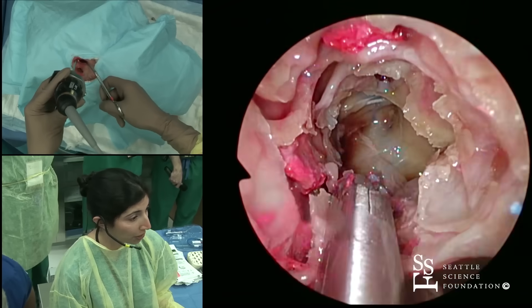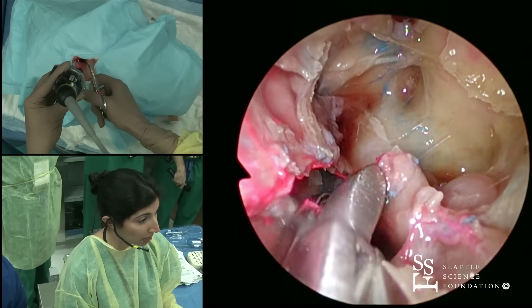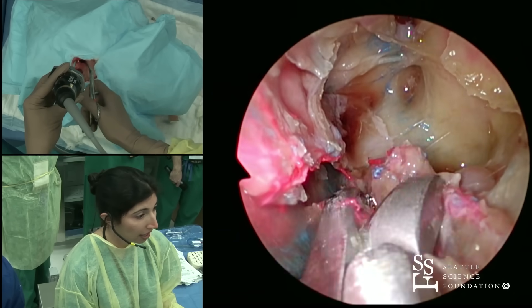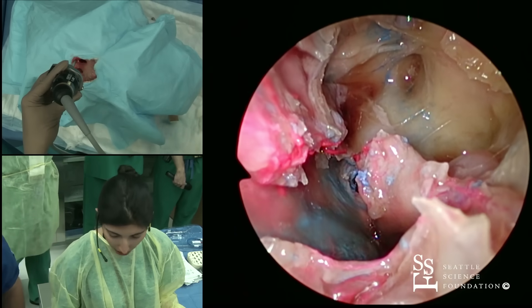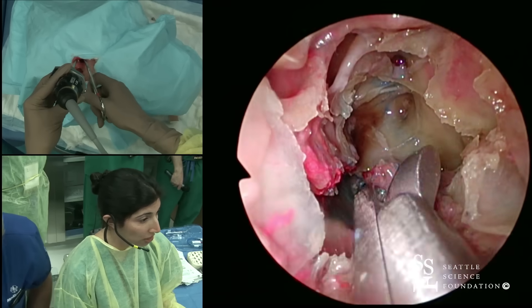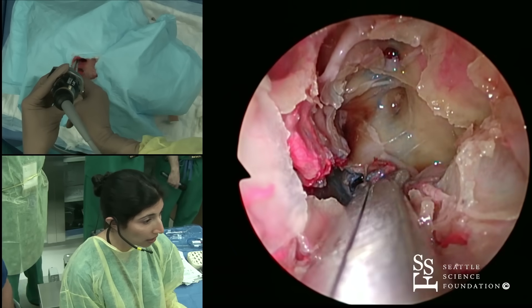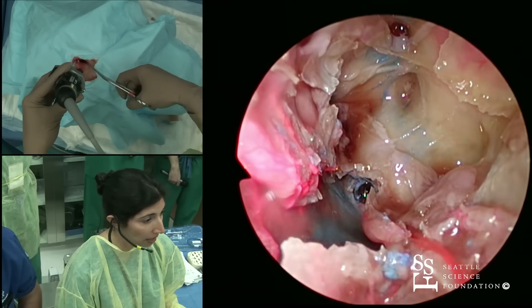I make sure that I have a lot superiorly left and I'm not going too high. But if I'm going to be opening my ethmoids anyway, then yes, I do. If it's an isolated sphenoid approach that I'm doing, then no, not necessarily. I can just move it aside and make sure that we take what we need and open up the sphenoid sinus there.